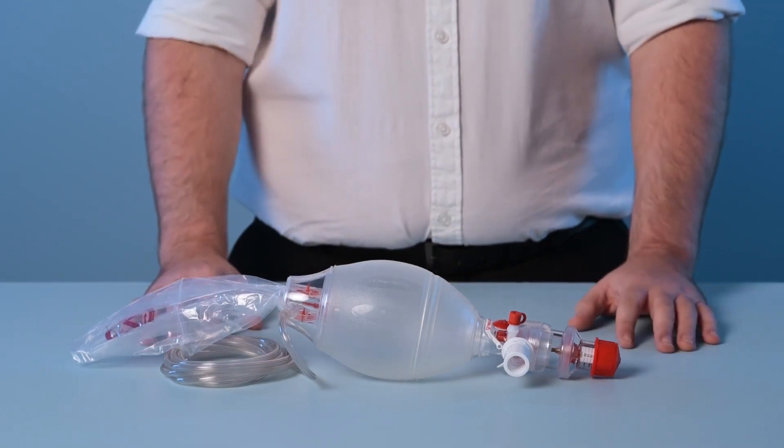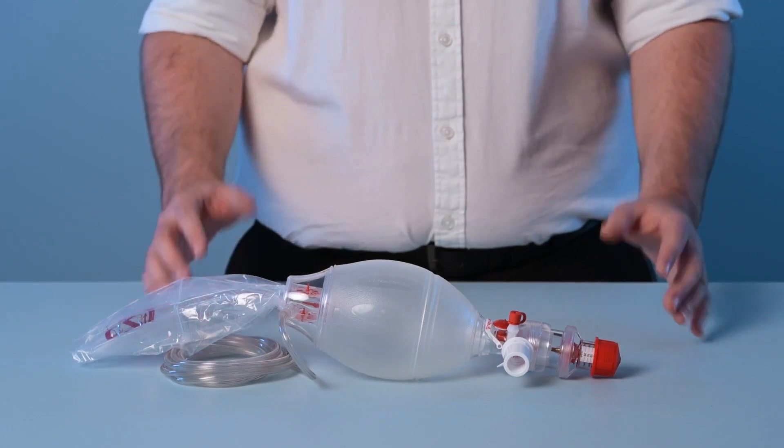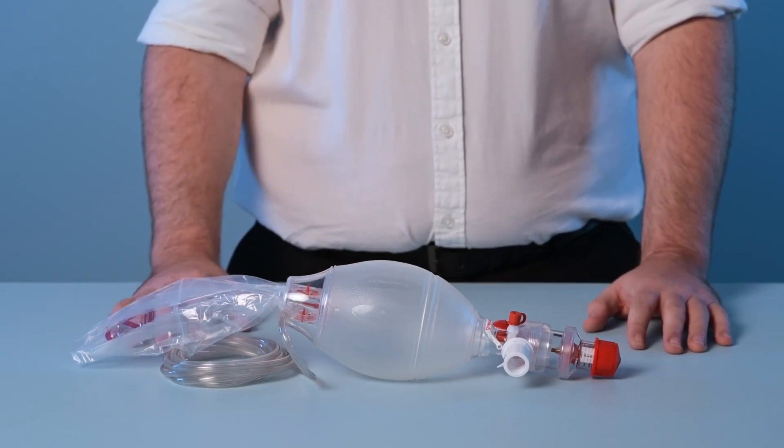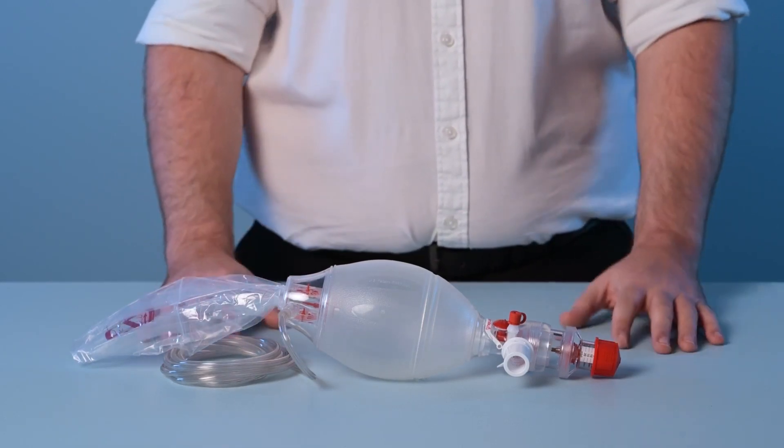On the Spur2, the pressure limiting valve system is designed to activate at a pressure of 40 centimeters of water. When the pressure reaches this level, the valve opens relieving the pressure within the system.